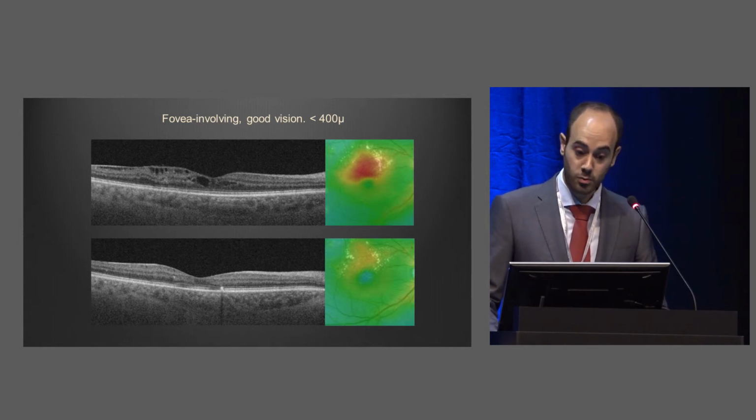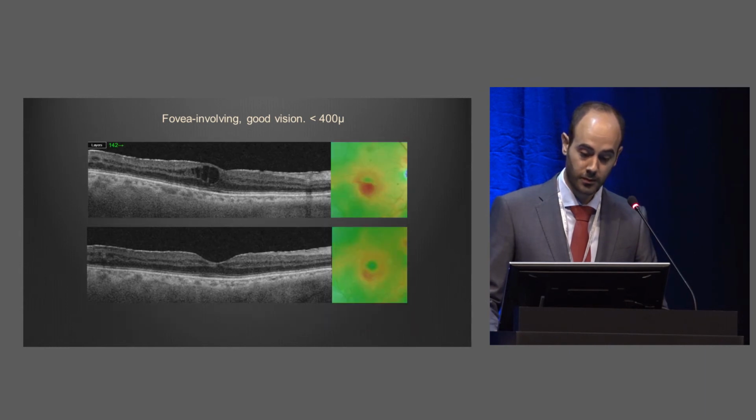Here, SubLiminal provides us with an extra tool. As I said earlier, I don't treat the fovea, but I go quite near it. Nice improvement after 3 weeks, thinning of the retina. Good vision, which is past 0.8, is preserved. One more case, very similar.